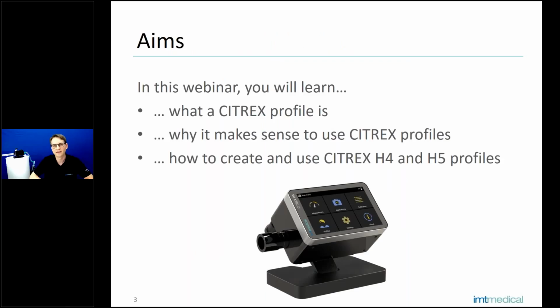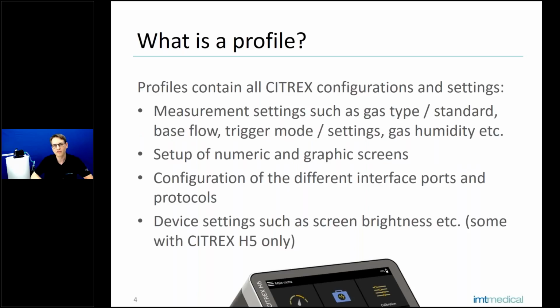Okay, so let's start. The aims of today's webinar session are that you learn what a CITREX profile is, why and when it makes sense to use CITREX profiles, and finally how to create and use CITREX H4 and CITREX H5 profiles. So what is a CITREX profile? A profile is a set of settings and configurations which we can save and load later on if we want to use the same settings and configurations again.